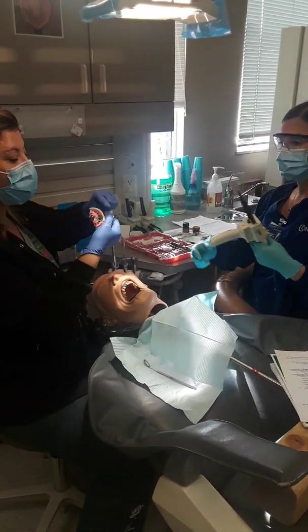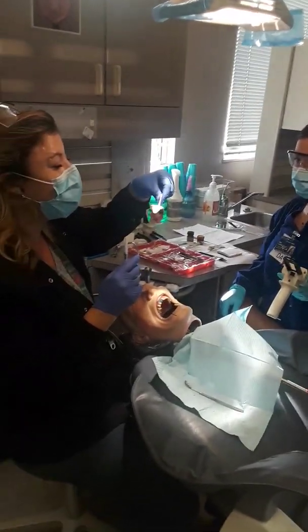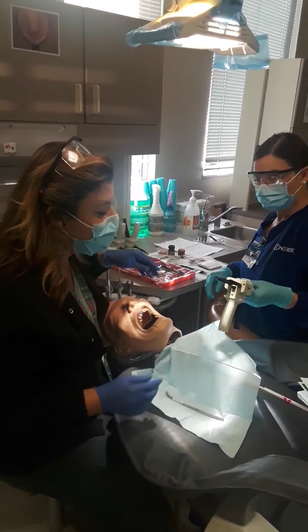Okay, this is what's going to actually get sent to the lab. I'll find what I was looking for. So this is going to get sent to the lab, so that's why we need it perfect. So we evaluate that. The lab slip's here, so you're going to put that together over there.